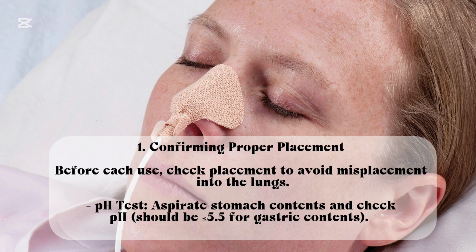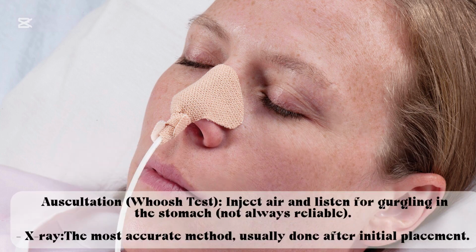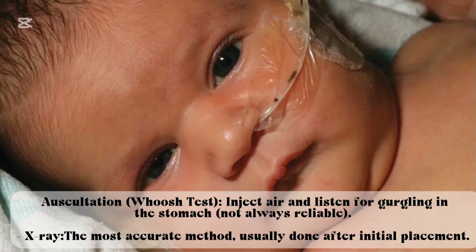1. Confirming proper placement. Before each use, check placement to avoid misplacement into the lungs. pH test: aspirate stomach contents and check that the pH is less than or equal to 5.5 for gastric contents. Auscultation, the whoosh test: inject air and listen for gurgling in the stomach, not always reliable. X-ray, the most accurate method, usually done after initial placement.